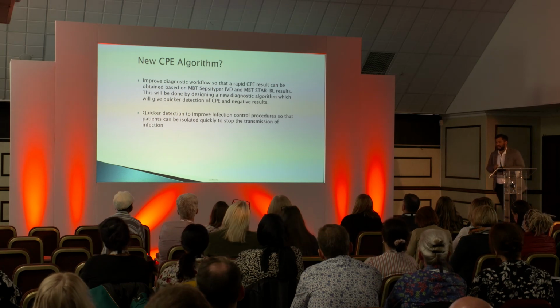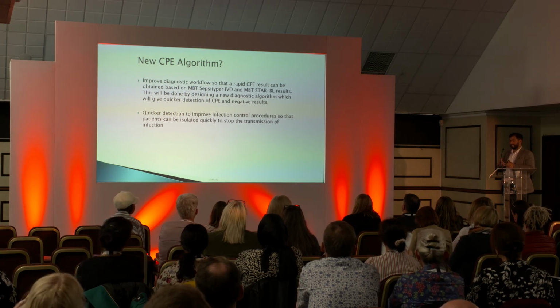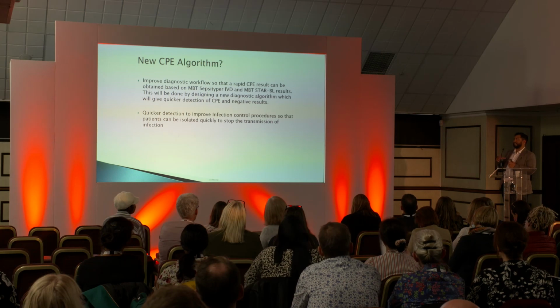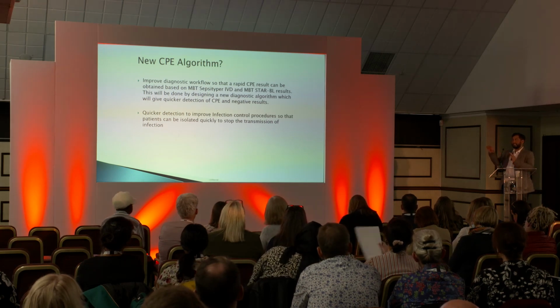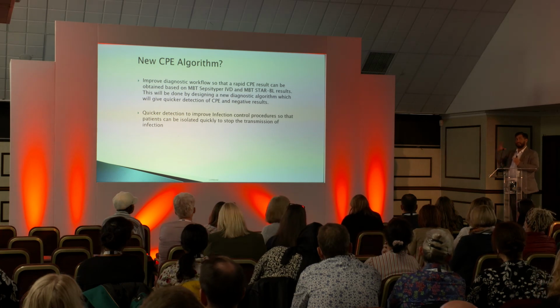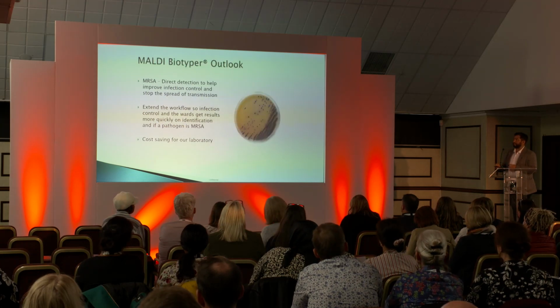So the new CPE algorithm is an improved diagnostic workflow so that a rapid CPE result can be obtained based on the MBT Sepsityper IVD and the MBT Star BL result. This will be done by designing a new algorithm which will give quicker detection of CPE and negative results. So this is being tested within our laboratory. So the scientist staff, when they're looking, know that they're following the correct workflow and that an organism needs to go through a certain stream to get that result out quickly enough, and quicker detection improves infection control procedures, as I've mentioned previously, and stops transmission.